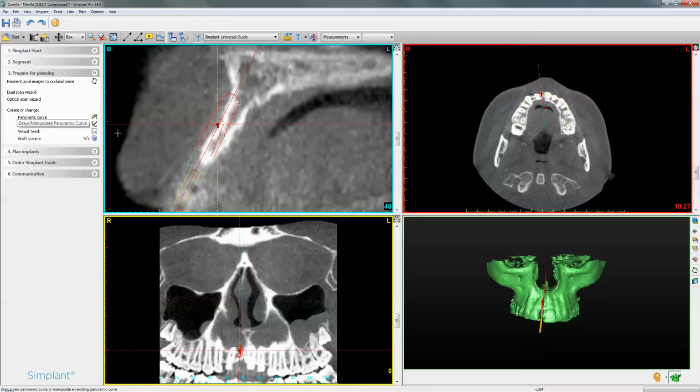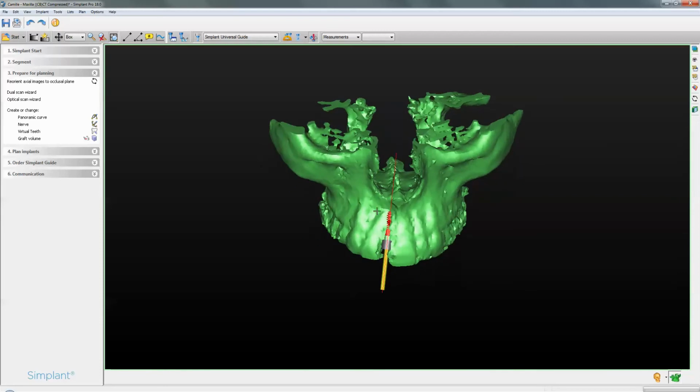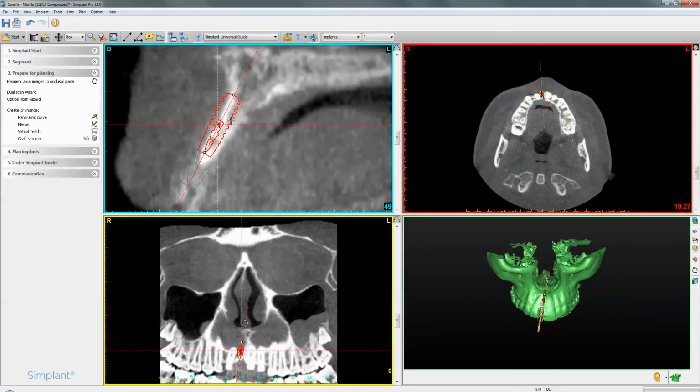So to start off, you just place an implant in, make sure that you get the implant in the right position, although this is quite close, not the best project, there's hardly any space, but let's say you do have an exposed implant. You have very limited bone, as you can see.